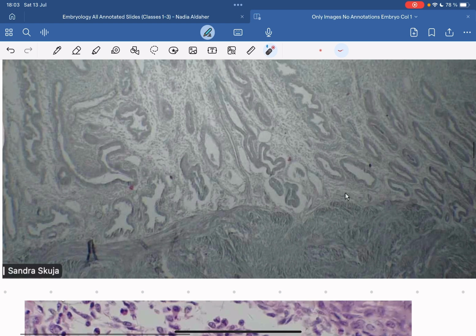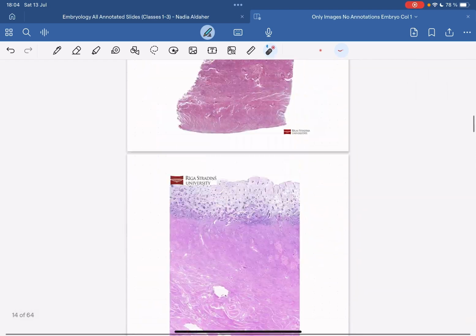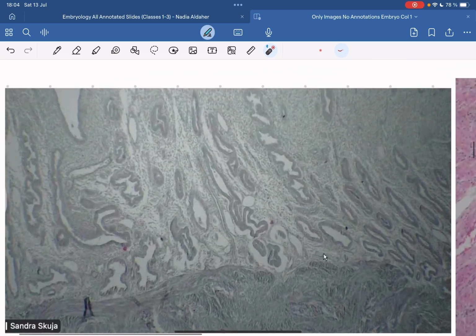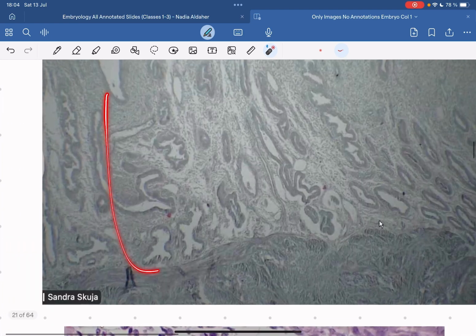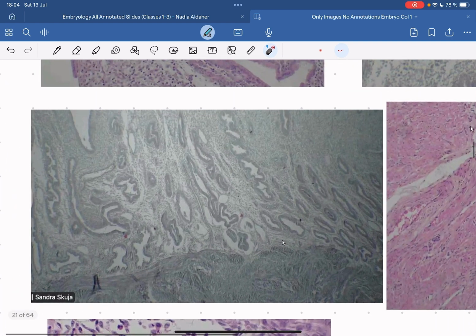Maybe stratum submucosa, maybe, but it's hard to find the line where stratum submucosa and vasculare begins, etc. So again, it's hard to show that border within the microscope. So that's why I doubt that those layers might come up. Definitely the layers of the endometrium might come up, but not those other layers.